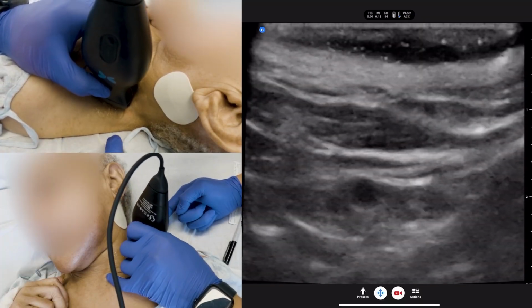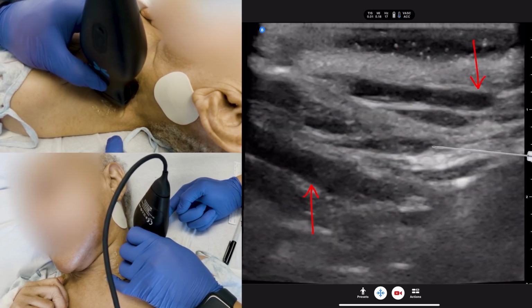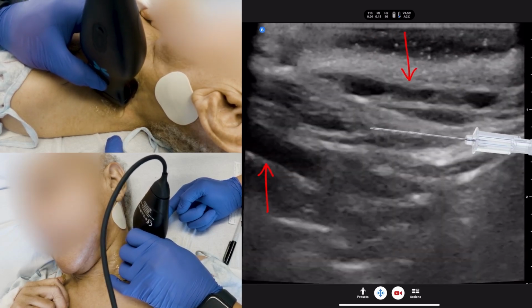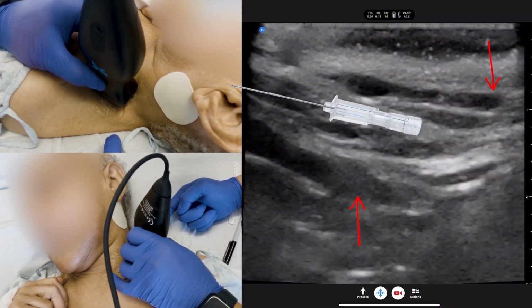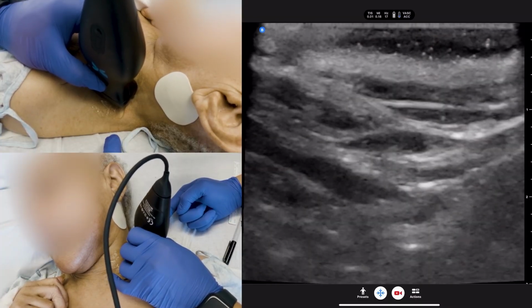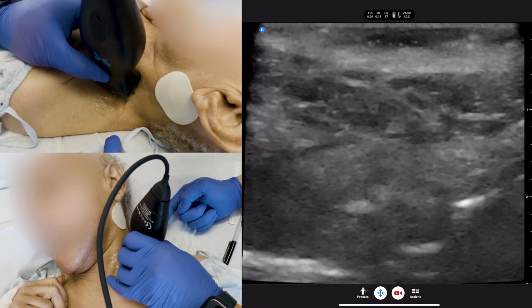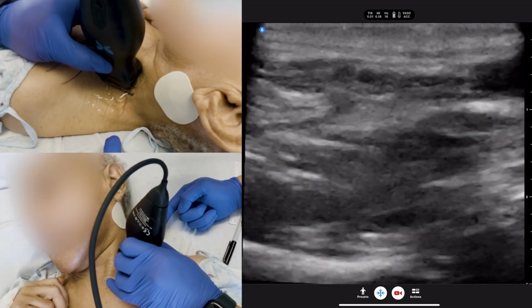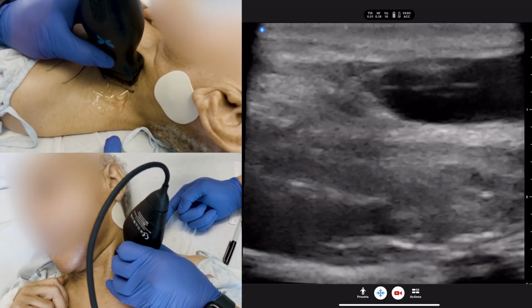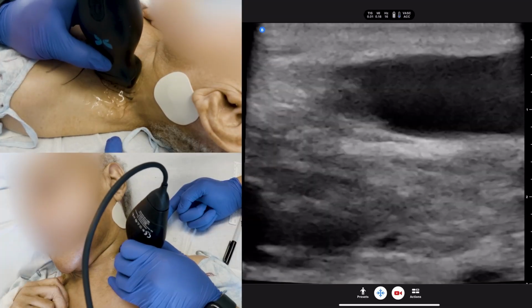Before I hit the plane of the EJ, I want to make sure that I'm sub 1 centimeter. So I need to make sure I'm underneath, and I'm going to bend the needle probably ahead of time. And then we're going to try to continue on. I see no other objects that will get in my way, and then we'll hit the IJ from here.